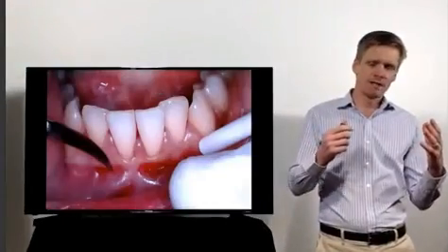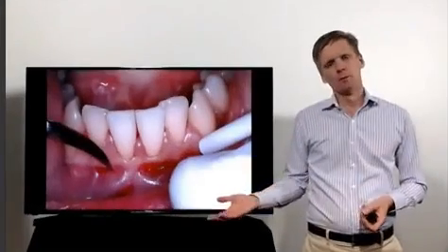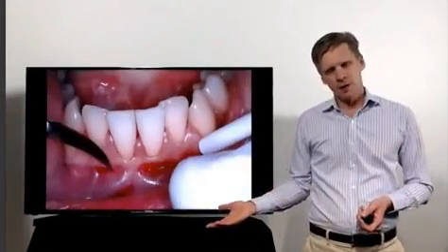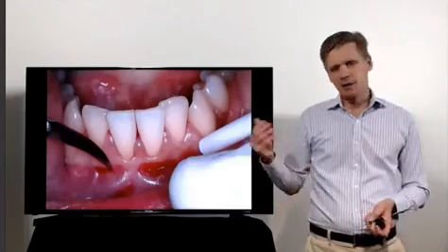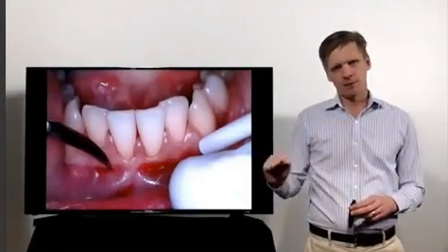Raising a flap — but we're not raising a full thickness flap. When we raise a normal flap, we lift the entire thickness of the soft tissue and the periosteum off the bone. What we're doing with a free gingival graft is a sharp dissection.